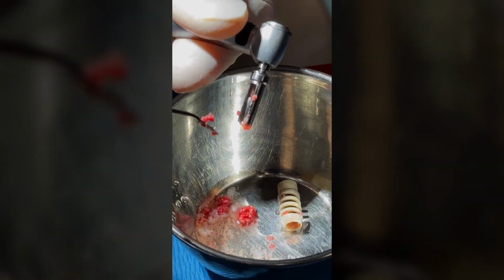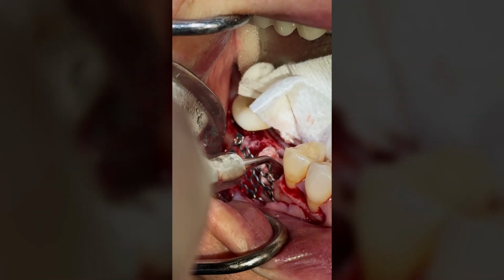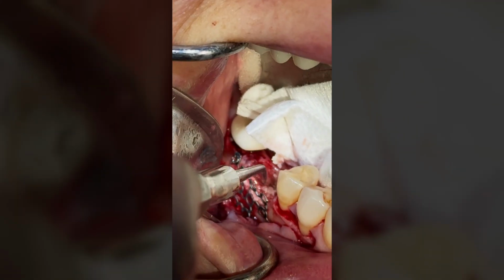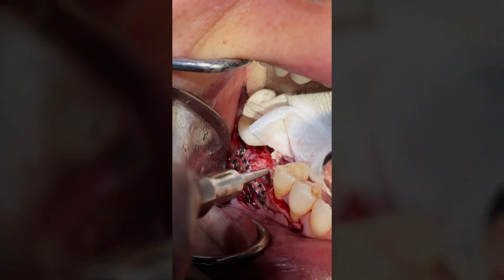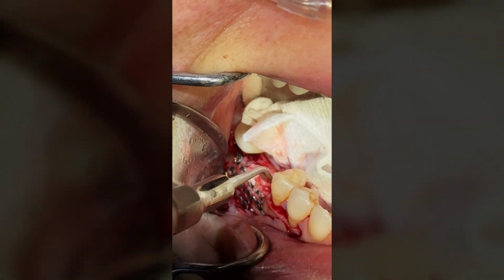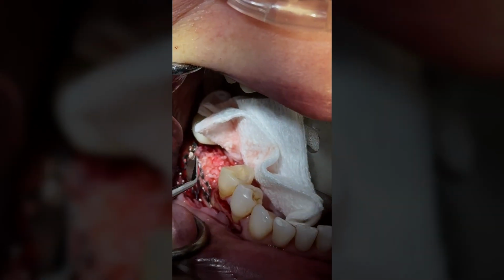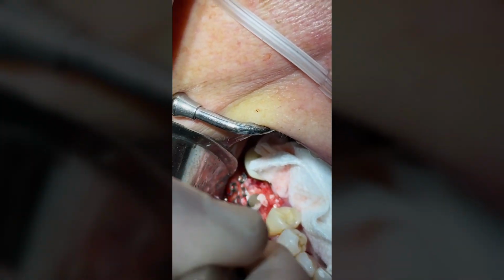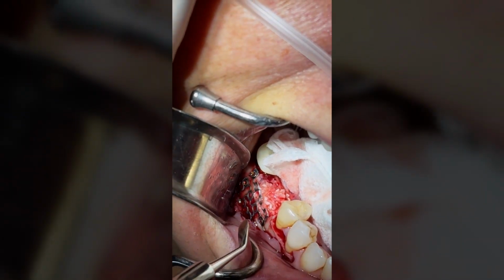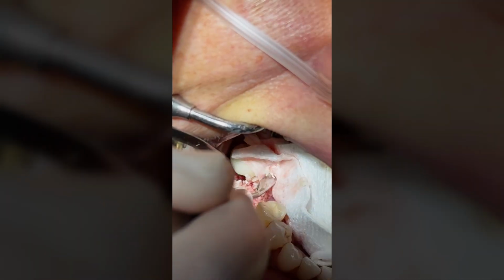As you can see, it's the most important part of the procedure. Why? Because this autogenous bone carries the biological and growth factors for bone regeneration, so we use those to regenerate bone. If we don't use those, or if we use only allograft, it will compromise the result. We can add some allograft. I would love to have 70% autogenous and 30% allograft, but not 70% allograft and 30% autogenous, because that will compromise the result. So we fill it out, and then we do a primary closure of the area.